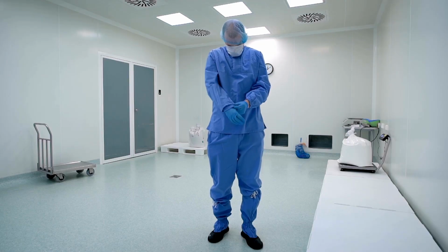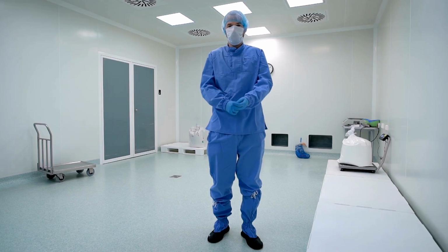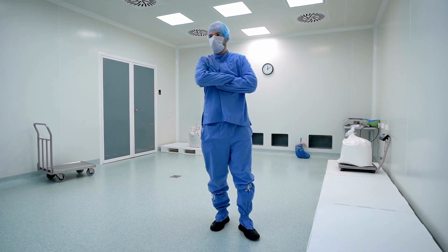In conclusion, ensure BI storage is appropriate, and second, ensure that the independent spore count verification is occurring for each batch of BI utilized, whether it be for sterilization validation, biennial requalification, routine sterilization, etc.